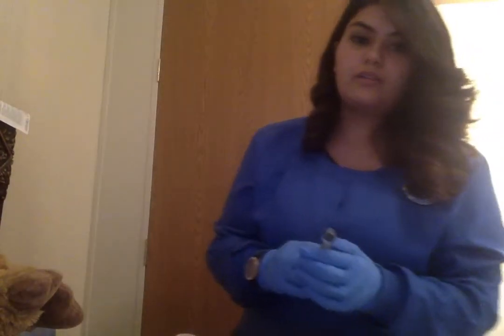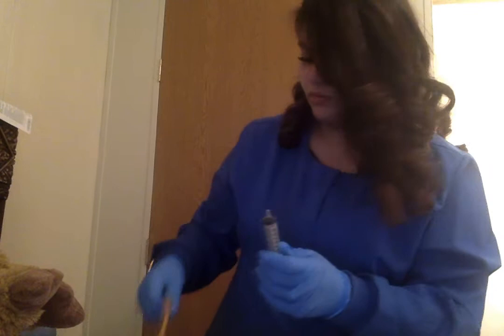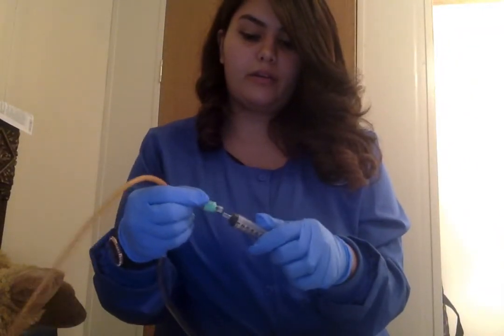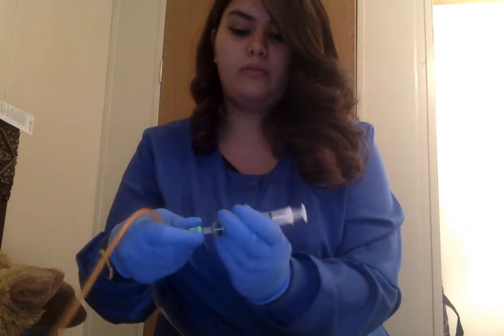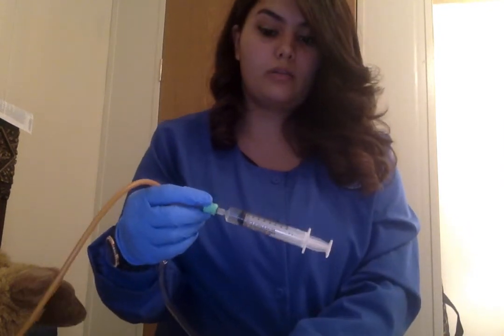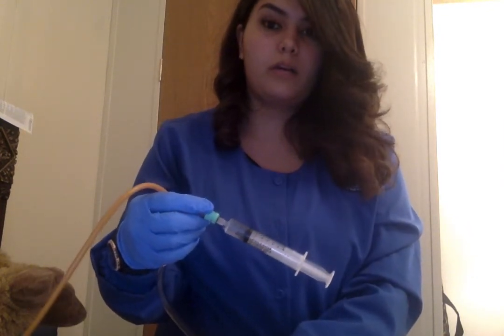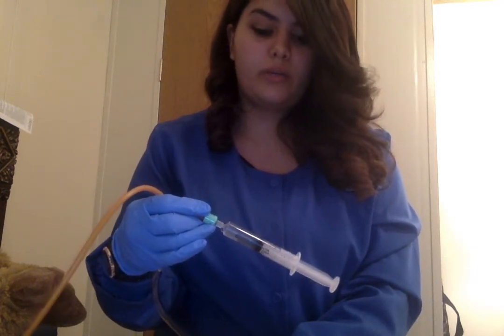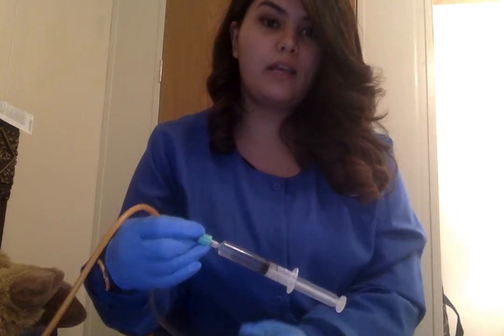Okay, so we're going to get our syringe. We are going to connect it into the catheter and we're going to let it drain on its own. All the water should just come right on out. So we want to get the same amount of fluid out as we pushed in, and we did.